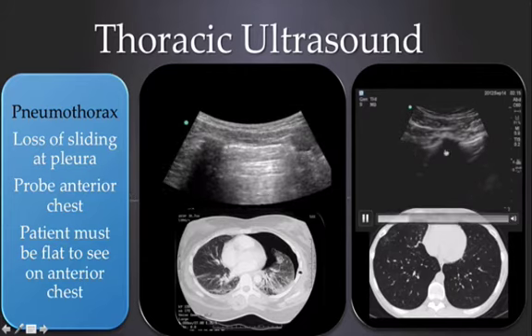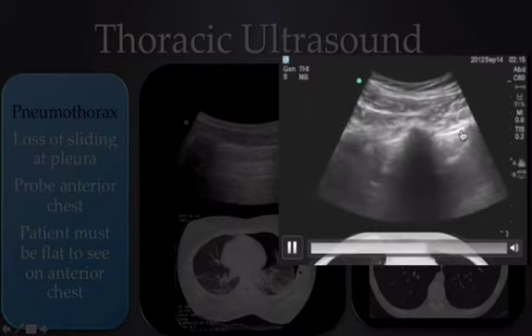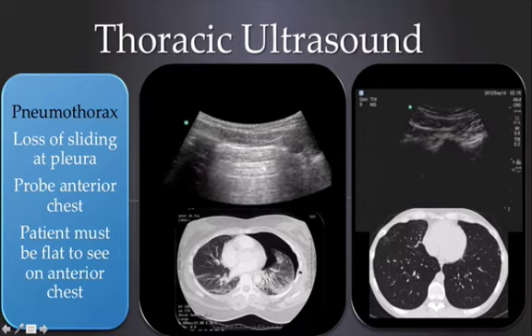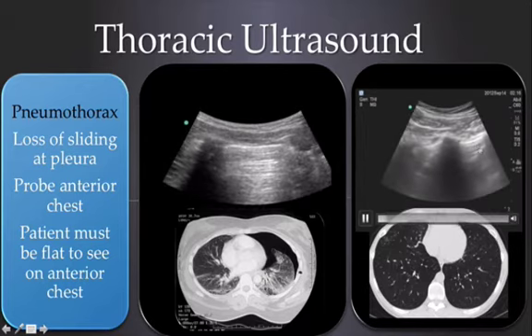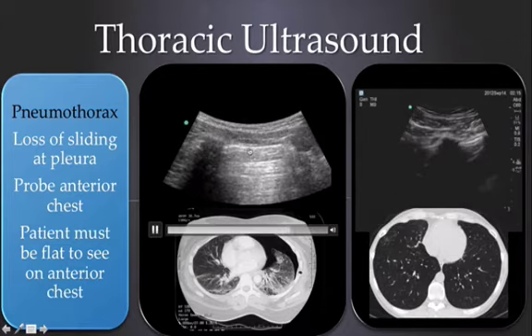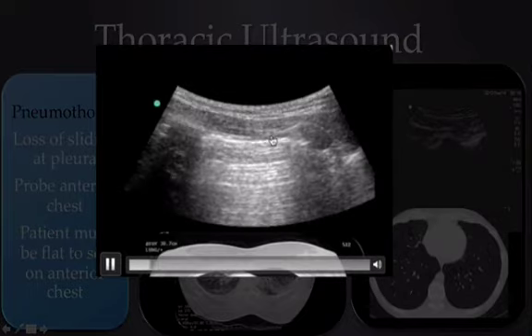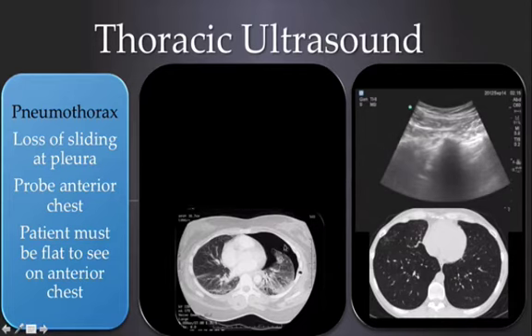So as we looked before, we identified the rib. Here's the rib in shadow. Here's the pleura. And we looked and there's motion of the two pleura against one another because they're adherent, as they are in the CT scan. The two pleura are one against each other, so as the lung slides due to inspiration and exhalation, we have sliding of the two pleura against each other in this sliding motion. In this case, we identified the ribs, we identified the pleura, but there was no sliding of the pleura. And that's because we're only able to see one of the pleura.